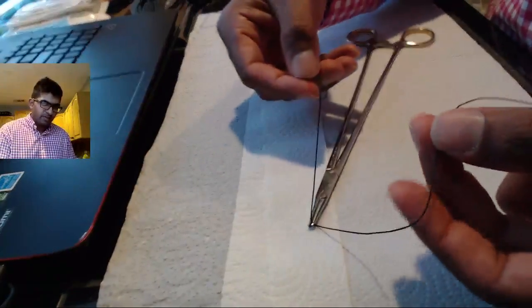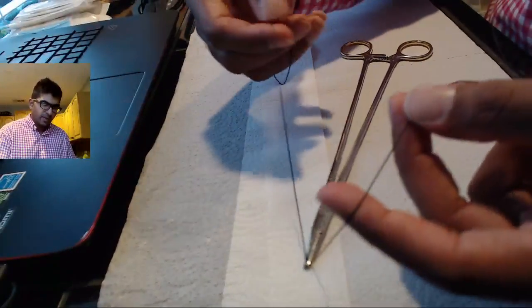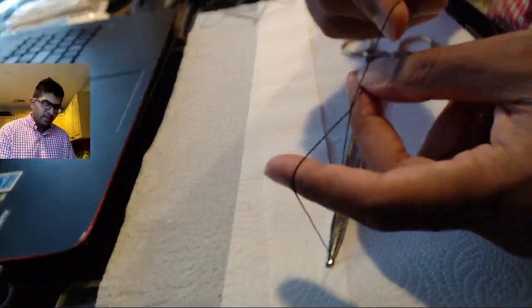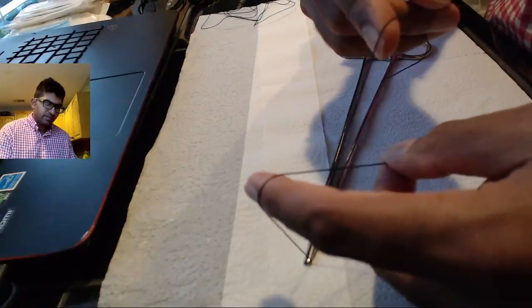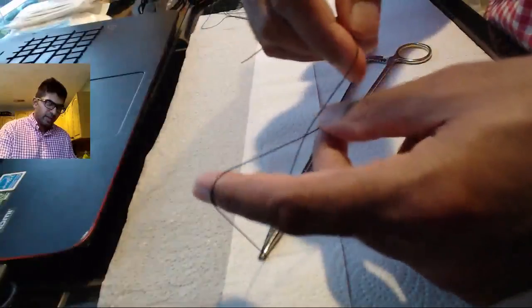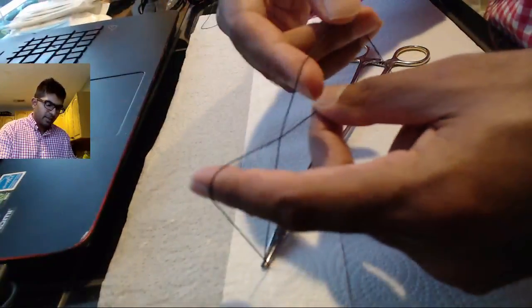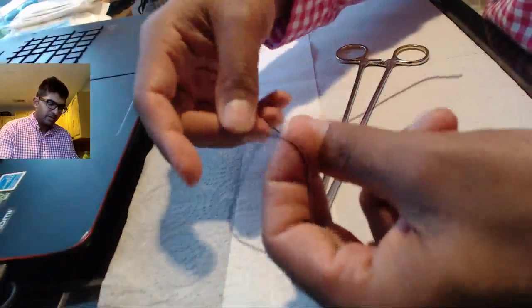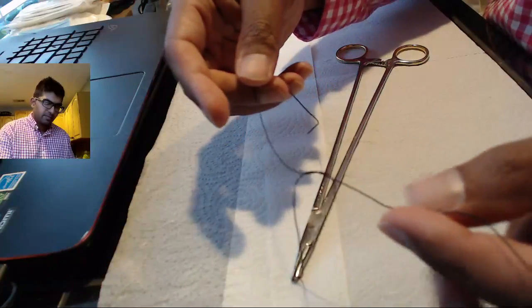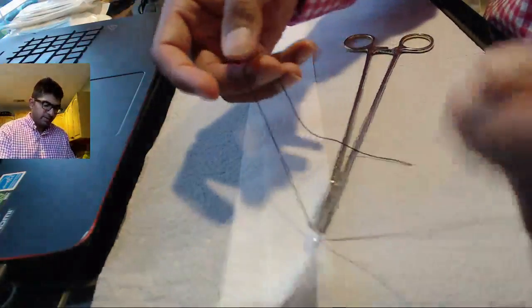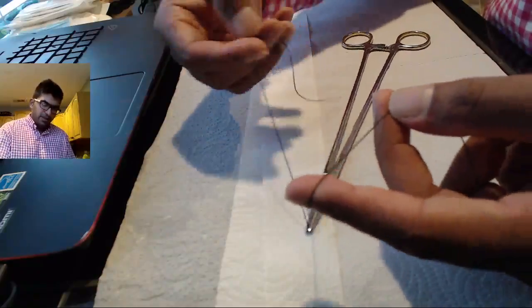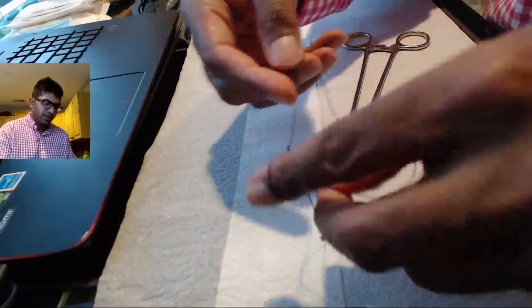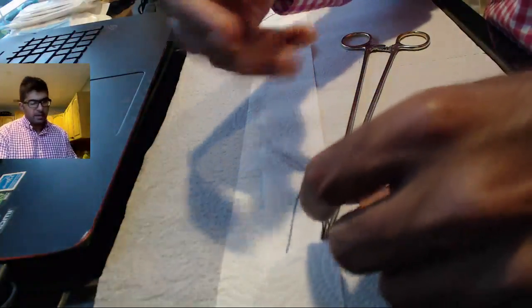We're going to do that a few more times in slow motion, just so everyone can see what happened. Thumb and middle finger, index finger. With my right hand, I'm using the suture and making that triangle shape. And you can see it's pushing on the other side. Then with my index finger, looping around, grabbing that suture. I'll show you one last time before we move on with the backhand. Again, thumb and index finger, left hand, right hand comes in, loop my index finger down, and I grab it. So that's our forehand throw. Feel free to pause it, rewind, do as much as you need so you can get that.